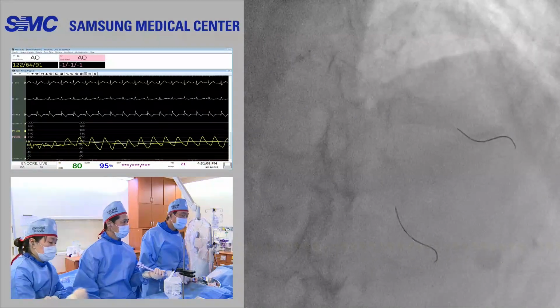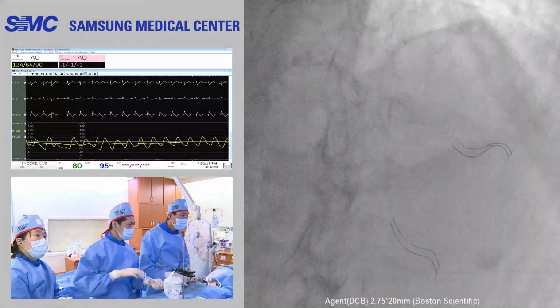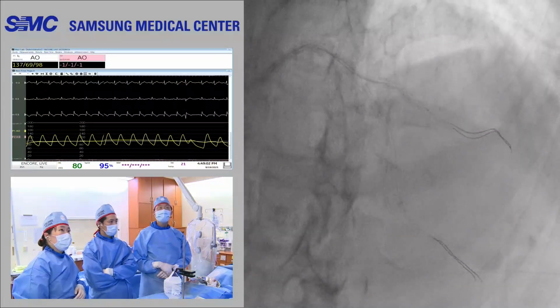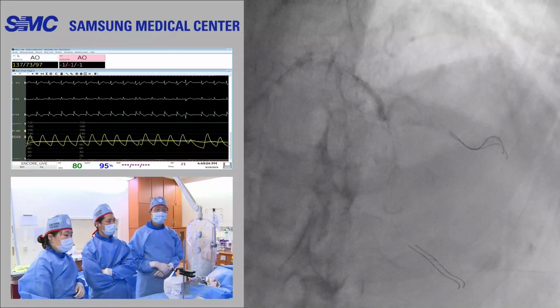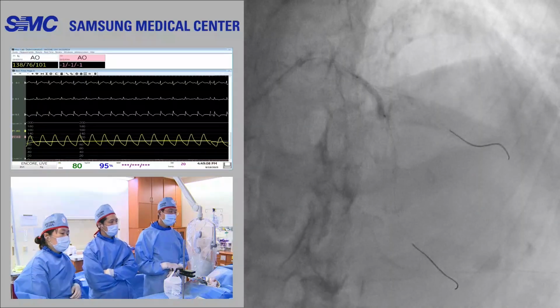We have to move to the Royal Victoria Hospital. Yeah, so I'll have to go there. Okay, it's okay. Okay, Dr. Gwon, we are back. Welcome back. You have 5 minutes. Okay, so you treated the DCB, the side.